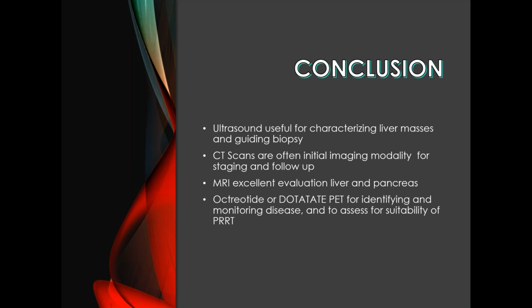And at the end of the day, it's the surgeon that actually has the best ability to pick up tumors. I'll say some of our surgeons here in Foothills will go to neuroendocrine tumor rounds, and all the imaging modalities, DOTATATE, MRI, CT, will not show any liver metastasis. And then the surgeon, Dr. Pasieka, will say, I put my hand over the liver and I could feel the metastasis studding the liver. I can feel the tumor when I'm in the operating room, and I can feel the bowel.